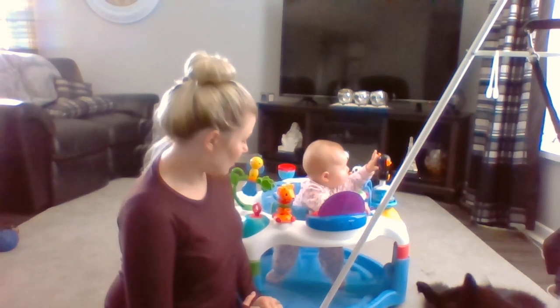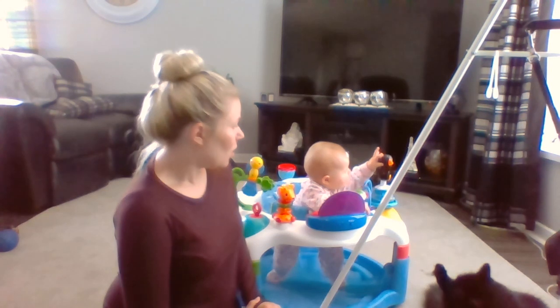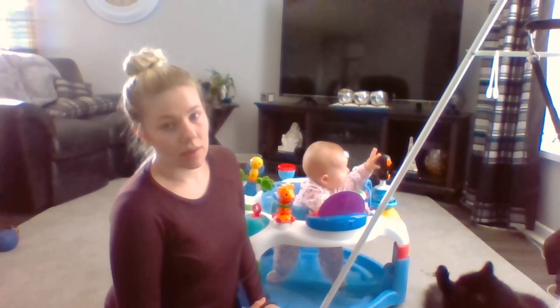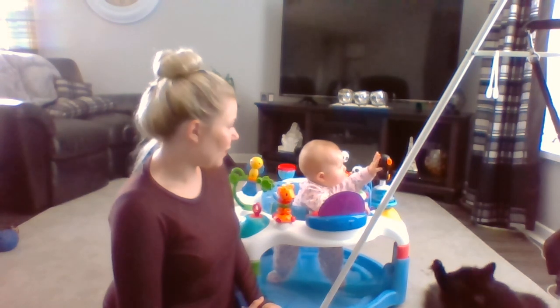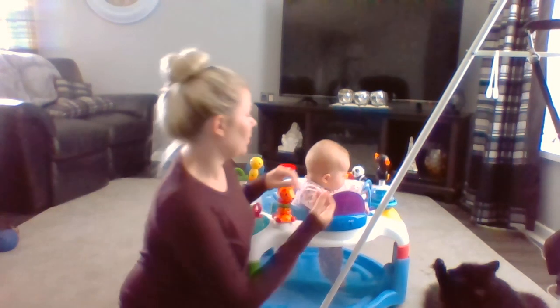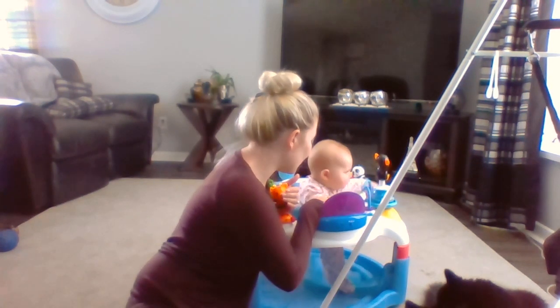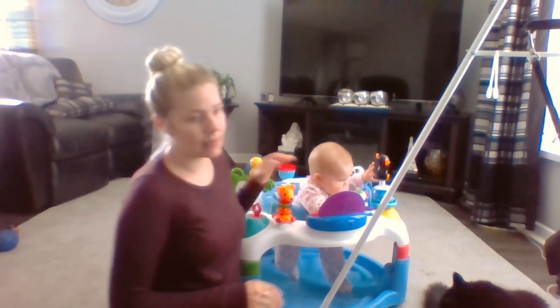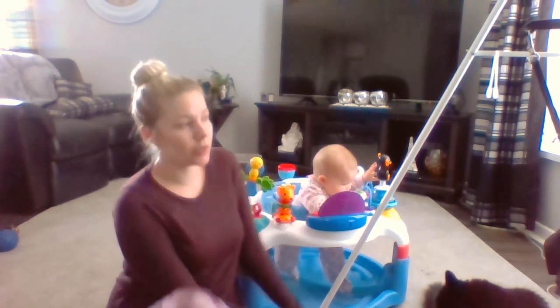Good morning, my name is Jerica and I'm a student with Mohawk College. I would check their information against two forms of identification. My patient obviously cannot talk, so I would check their wristband. Sloan Smith, date of birth November 22nd, 2019. Excellent. The next thing I would do is my 3 checks for medication administration.